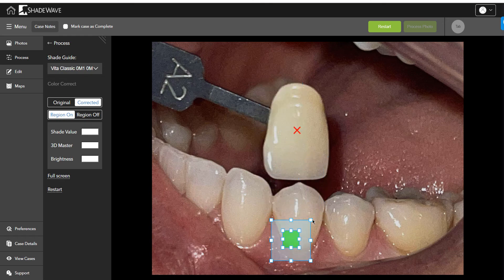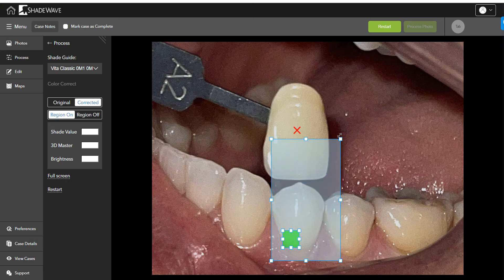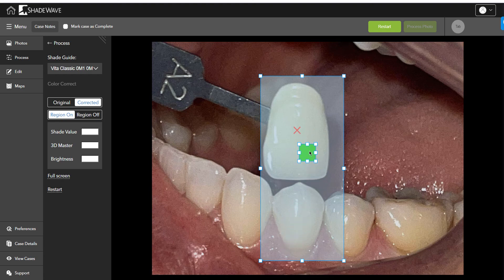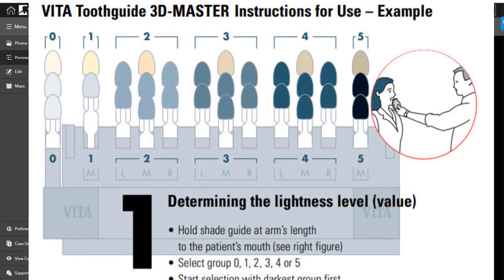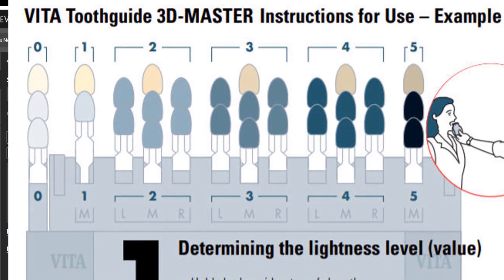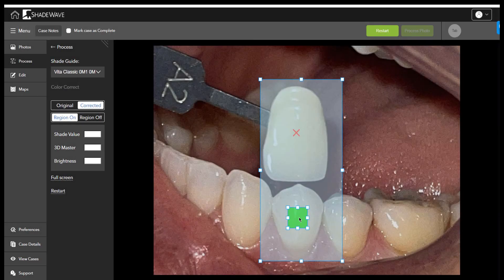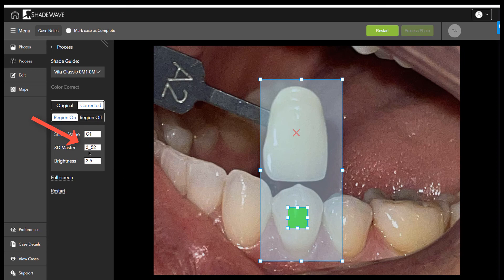Normally you'd make the region slightly larger than the tooth you want to get the shade on, but for illustration purposes we'll include the tooth along with the shade tab. This green box gives you value in the 3D Master value groups, which are 0 through 5 — 0 is the brightest and 5 is the darkest. When you click on it, it will put the answer right here. Clicking on the tooth, it tells us it is a 3.